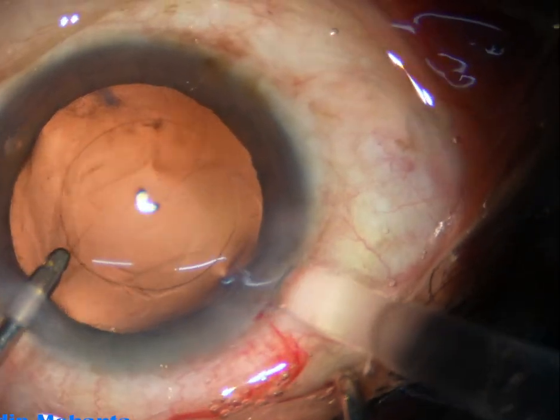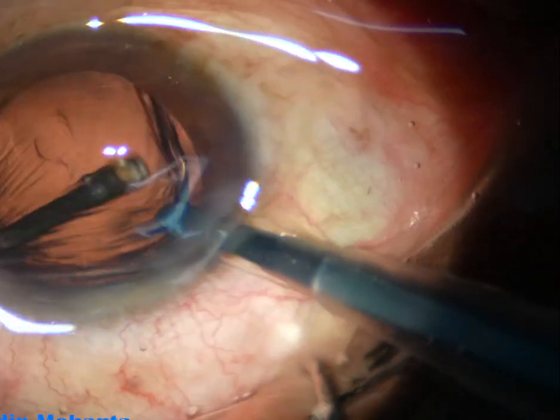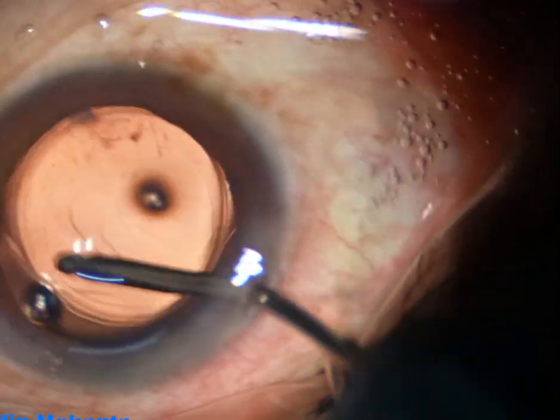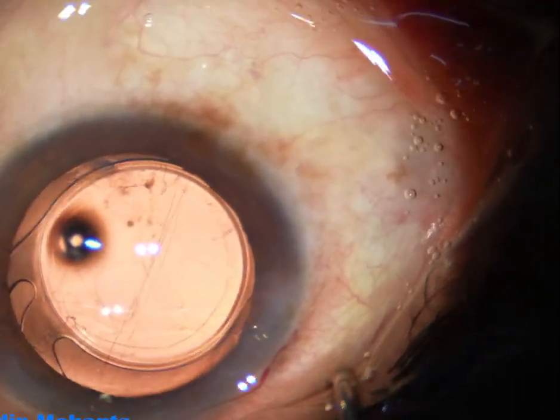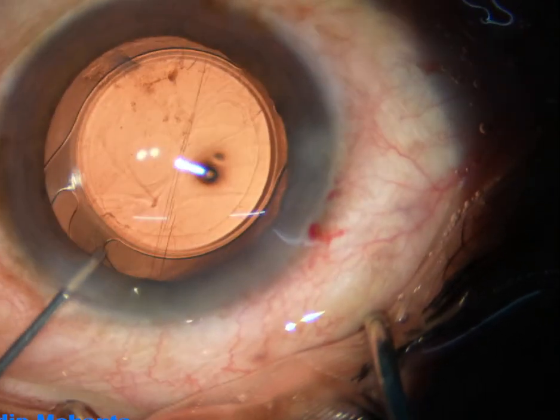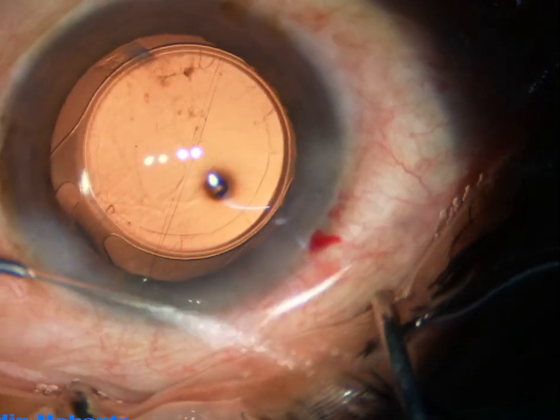Now hydroimplantation of a single-piece monofocal intraocular lens is done. This is the Lumera T microscope by Zeiss and the camera is the Alpha 7S III by Sony — a beautiful combination.